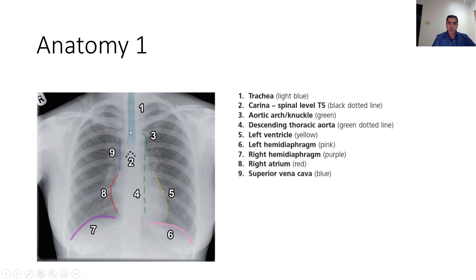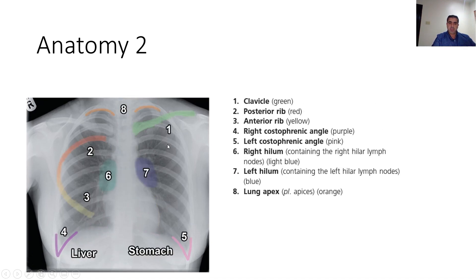Important anatomical landmarks that you should know include the trachea, then the carina which is at the level of T5, then the aortic arch and the descending aorta. The left border of the heart is composed mainly of the left ventricle. You should also know both right and left hemidiaphragm, and the right border composed mainly of the right atrium and the superior vena cava. Other important bony landmarks include the clavicles, the posterior ribs, and the anterior ribs.